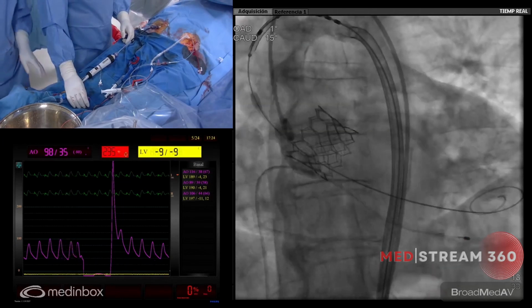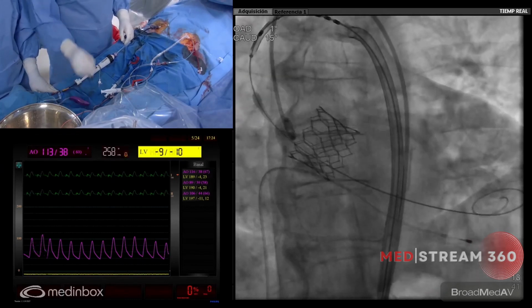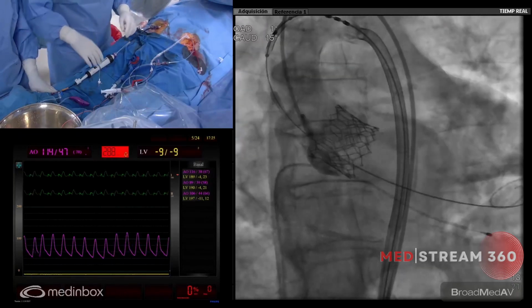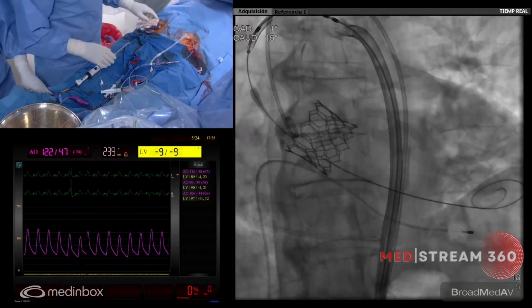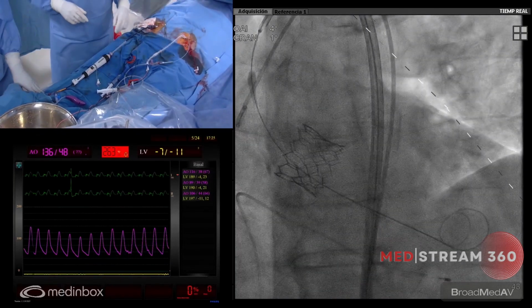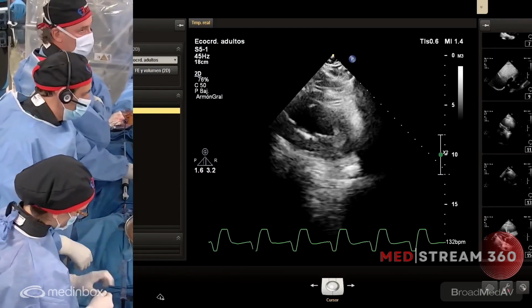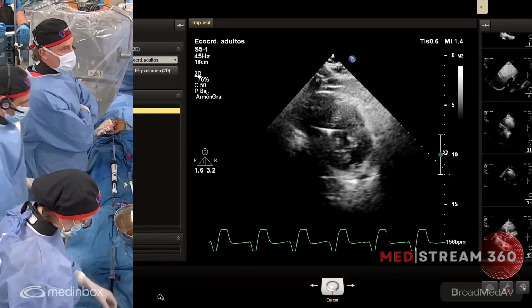It's almost perfect because on the non-coronary cusp it is probably a 3 and probably 4, 5 on the left. Diastolic is now, well, the patient is still hypotensive, but I think we don't have to post-dilate anymore. Dr. Mukarsel is going to check because if we have a good outcome, I don't like to overstimulate this patient again. So let's take a look. Just a sec. So LV function is normal. So we have good ejection fraction, no effusion at all.